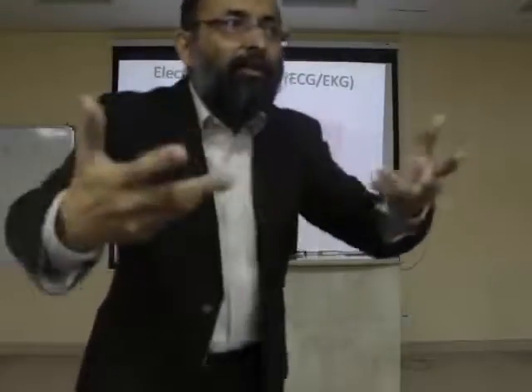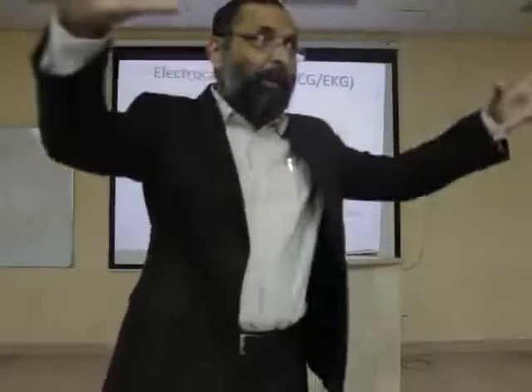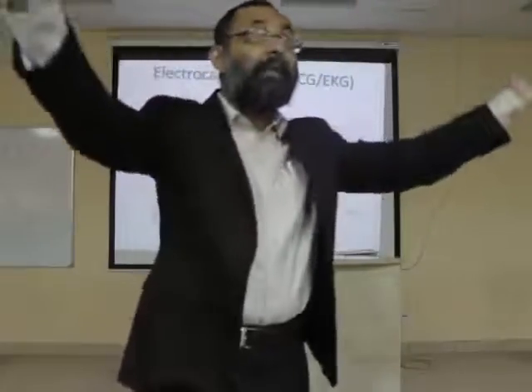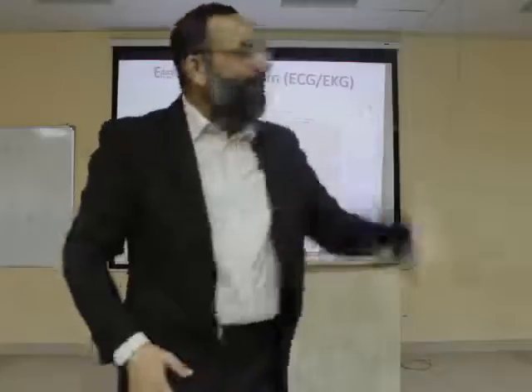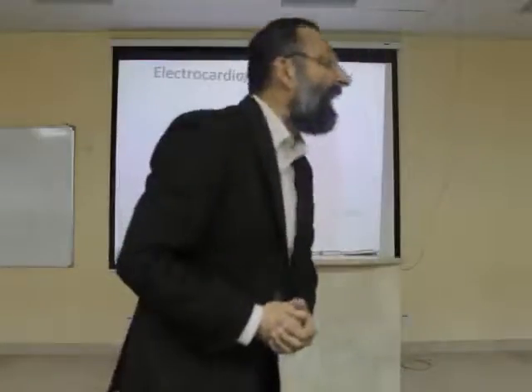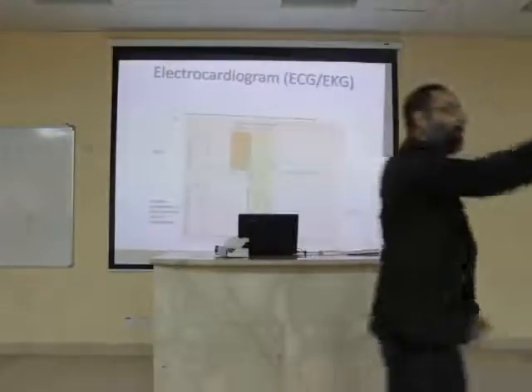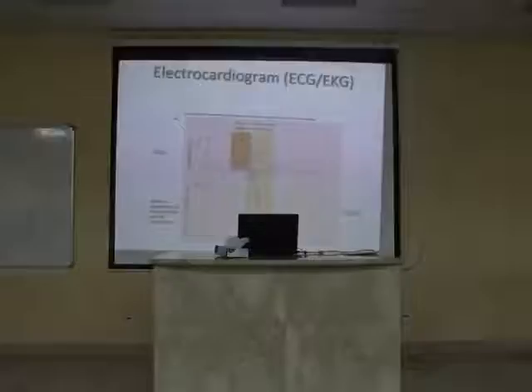By combining these two, you are describing the atrial spread, you are describing the AV nodal transmission, that is, you are describing the complete what? Yes, the word is complete atrial electrical activity. This is the word we want. If I say, tell me about the complete atrial electrical activity, the answer is the PR interval.